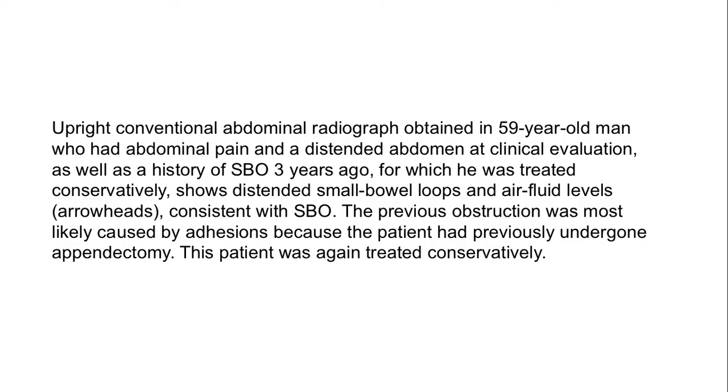So clinical history is extremely important. You cannot rely only on the appearance of the radiograph. When you have a clear clinical history for the patient, you would somewhat predict what's going to appear on the abdomen x-ray. So yeah.